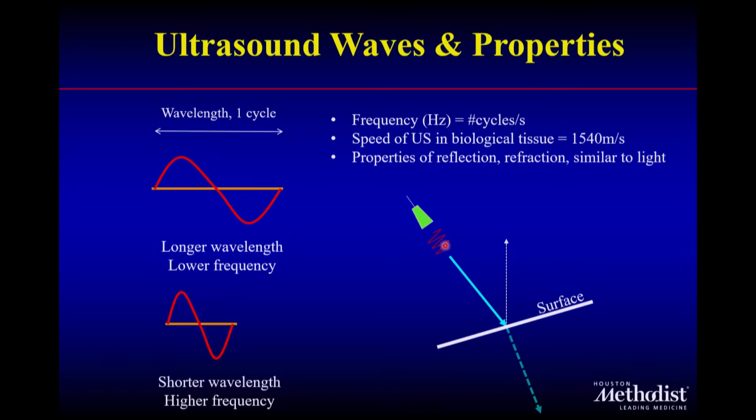The interesting thing is, a little bit is reflected and quite a bit is refracted. Otherwise, you're not going to be able to see the distant structures of your heart. Right? So still some of it goes further down and gets reflected again.